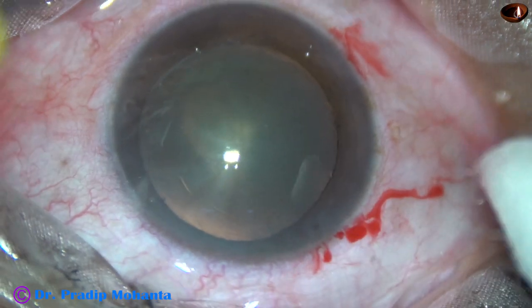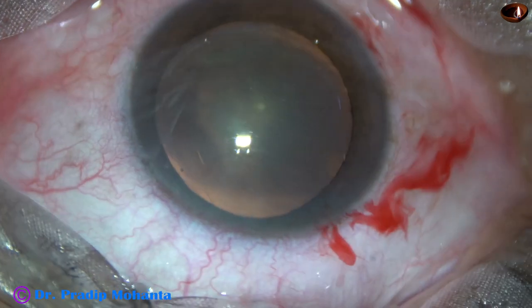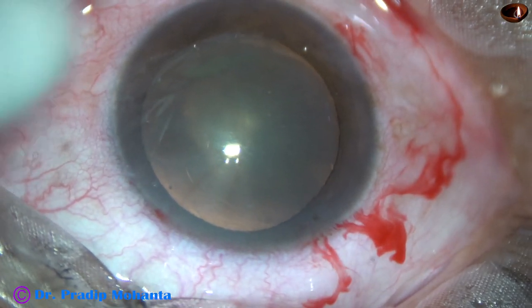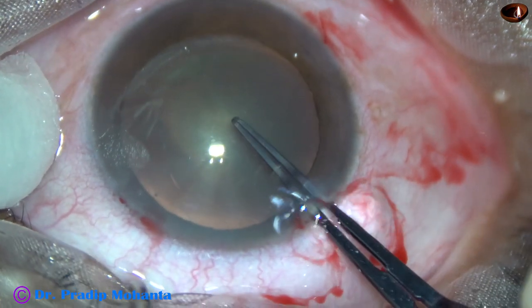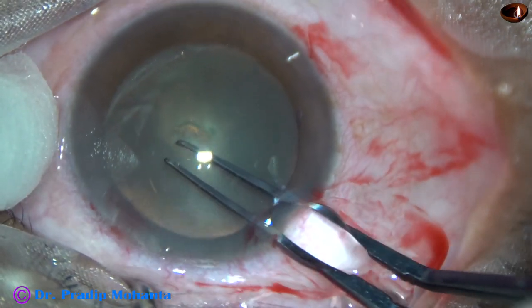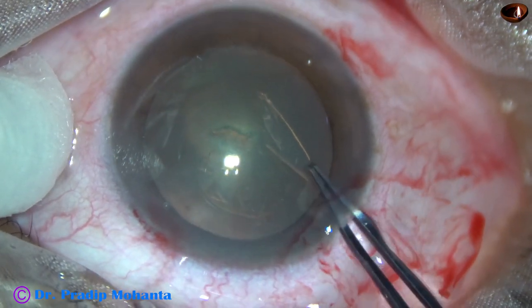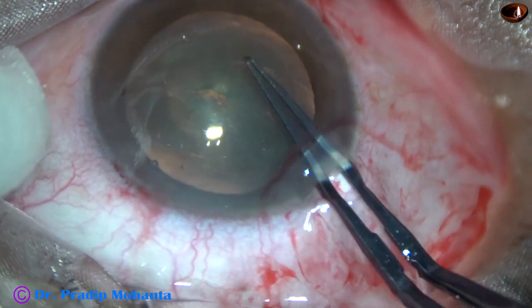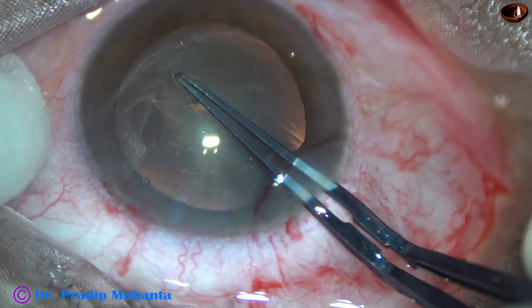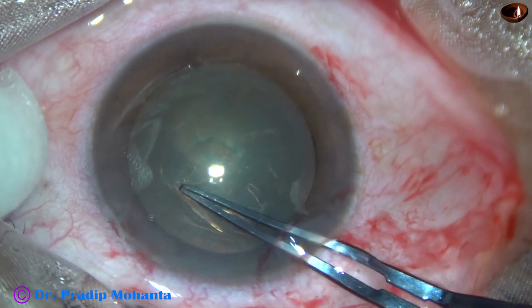Then, another side port is made on the left side of the main incision. Now, capsulorhexis is done with the help of the utrata forceps. The capsule is pierced at the center by the tip of the utrata, and a capsular tag is raised. This capsular tag is guided anticlockwise all around to get an adequate size rhexis of about 5.5 mm.